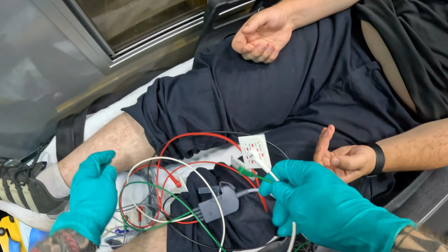I'm going to click again, and you see, very important, what you notice: noisy data. Would you accept? So the 12 leads were not connected. This cable was not connected right here. So it cannot read. If you see that alarm, it's very important that you reconnect this if you haven't done so already. I'm showing you, this must be connected for you to acquire the 12 lead.